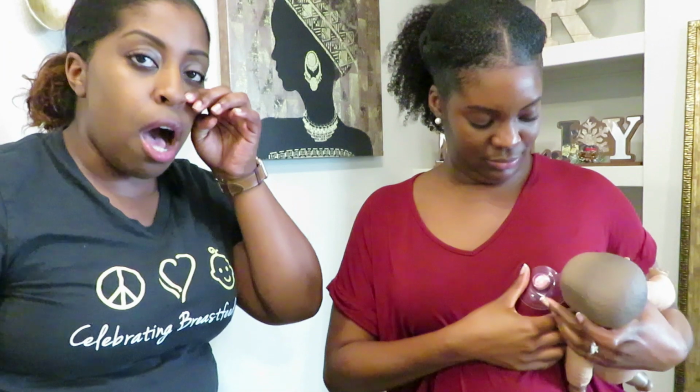So you can use the nipple shield. This is a size 24, which we use most often unless your nipples are smaller, then they have smaller sizes that you can purchase, or if you're in the hospital, you can request from the nurse or lactation consultant.